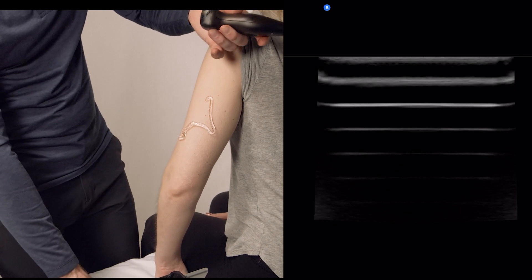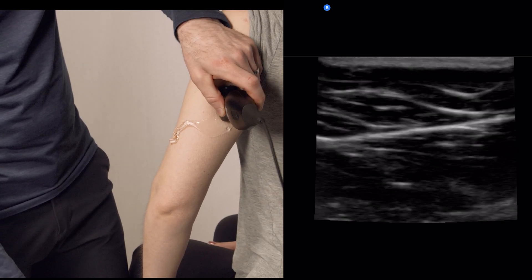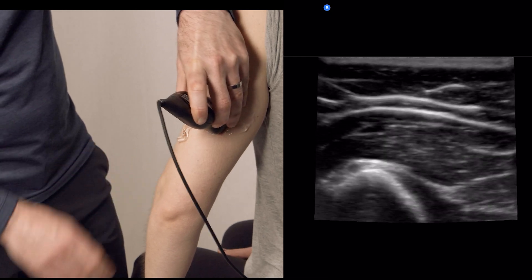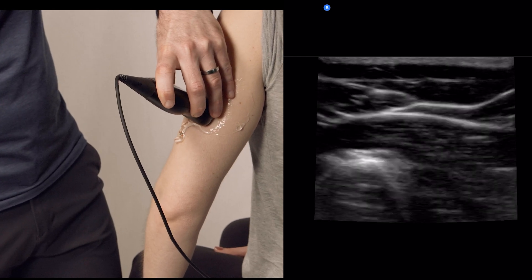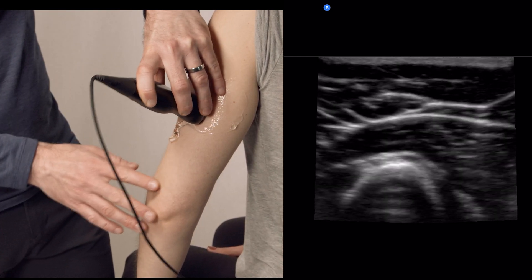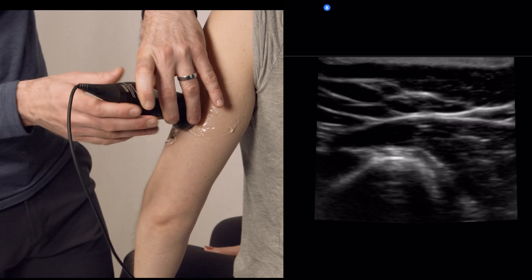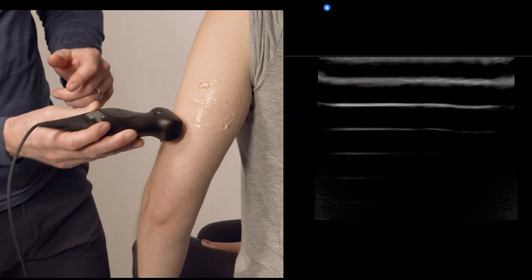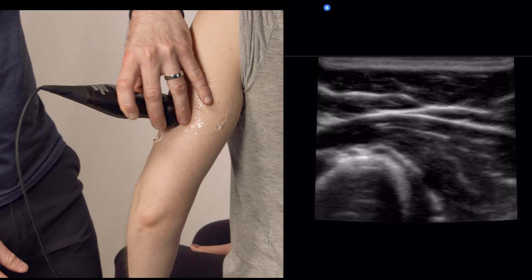We're going to use a musculoskeletal or nerve preset. The first thing we want to do is go to the mid humerus and find the humerus itself, just on the lateral aspect of the mid humerus. In this particular case, the left side of the screen is going to be anterior.